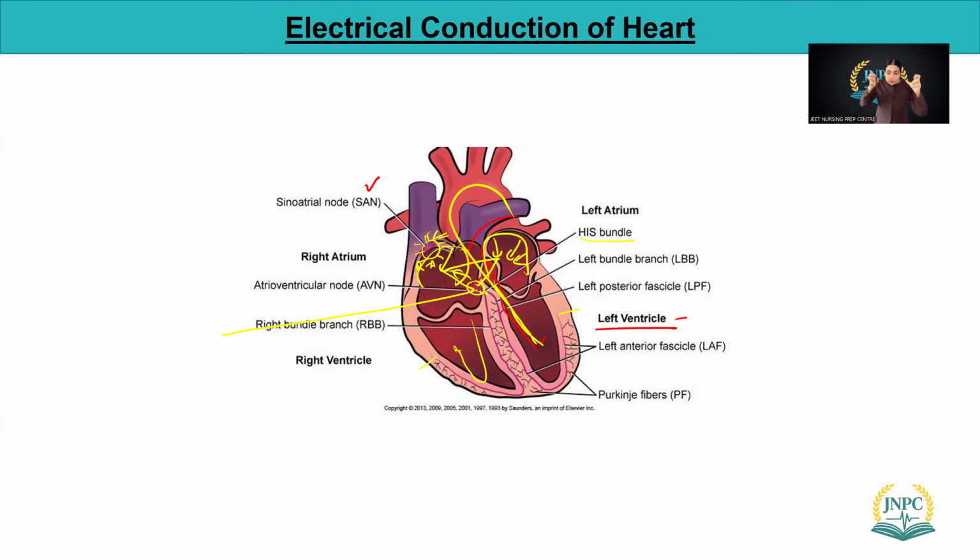So the atriums have already contracted. And remember what we said: whenever the pulse is there, that part is going to contract. Right now, the impulse is here in the AV node, in the bundle of His. So what is going to contract at this point? The bundle of His area, that means the septum area. The septum area is the initial part of the contraction of our ventricles.